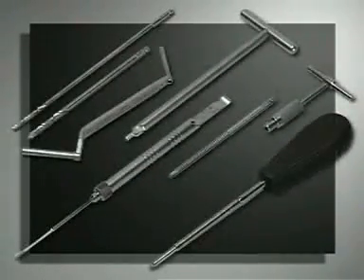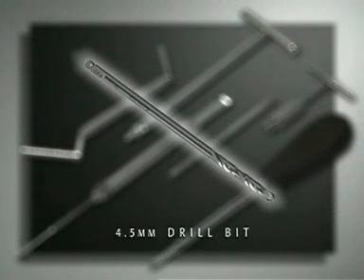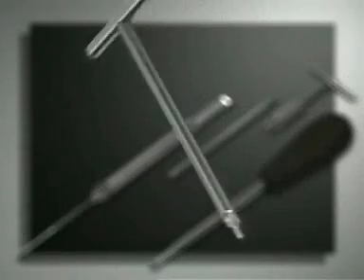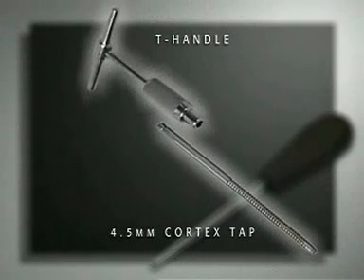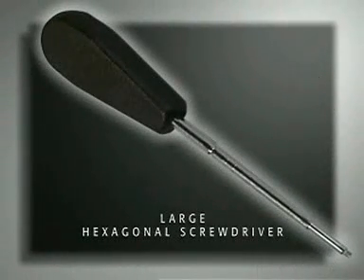The following instruments are required: the 3.2 millimeter drill bit, which is slightly larger than the core diameter of the screw, and the 4.5 millimeter drill bit, which is the same diameter as the thread of the screw. Also required are the 4.5/3.2 double drill guide, the countersink, the depth gauge, the 4.5 millimeter tap for cortex screws with T-handle, and the large hexagonal screwdriver.